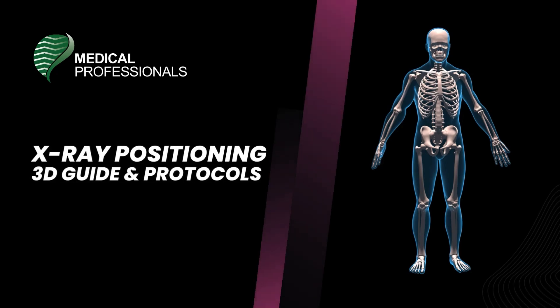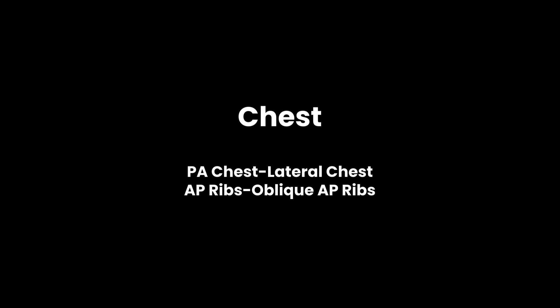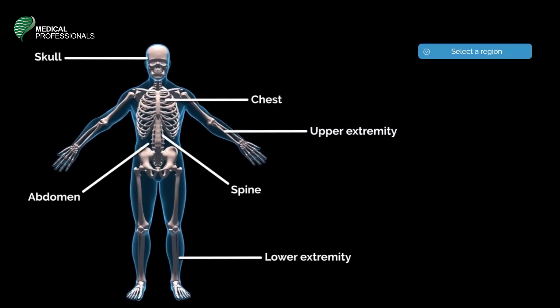Welcome to Medical Professional's new series on X-ray Positions and Procedures. In these videos, you will experience a 3D representation of radiographic protocols that will take you step-by-step into X-ray imaging procedures. This video is about radiographic imaging of the chest. The first position is a chest PA.